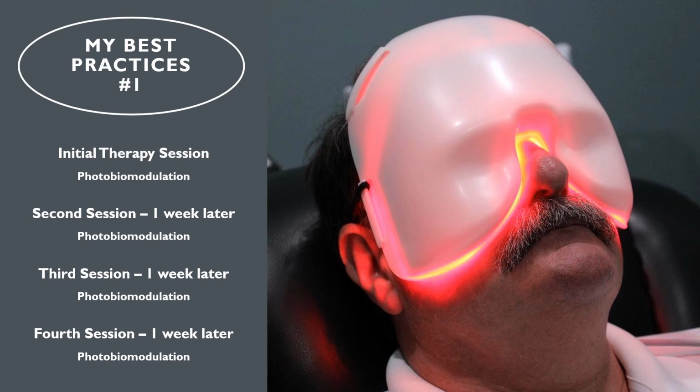So here's the first way you can skin a cat. I'm going to show you three different ways to do the same thing. On this guy, and again, for me, I feel pretty comfortable now, where I've done enough people and seen enough results to where I'm getting pretty good at saying, okay, I want to treat this person like this. I'm going to treat this person this way. I'm going to treat Miss Jones over there a slightly different way, even though all three of them have meibomian gland dysfunction as their primary disease.